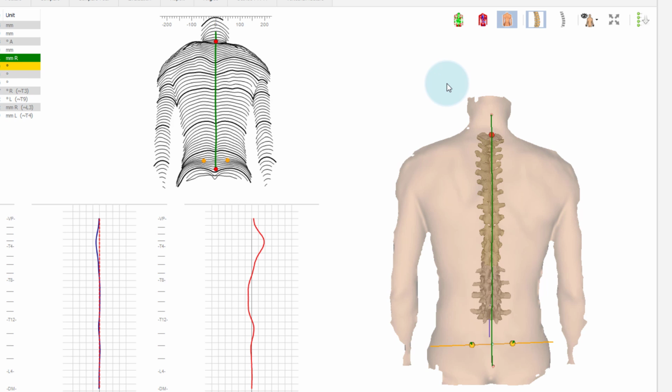The accuracy with which the surface is represented here is about 0.1 to 0.2 mm per measurement point in the XY plane and 0.3 mm in Z direction. Anatomical fixed points, VP, DL and DR, are placed with an accuracy of about 0.9 mm, resulting in a shape-related deviation in the bony model of the spine of about 2 to 3 mm in the coronal plane and 3 degrees in the transverse plane. These numbers may seem a bit high at first, but they are absolutely in line with the expected accuracies on an X-ray or an MRI system.